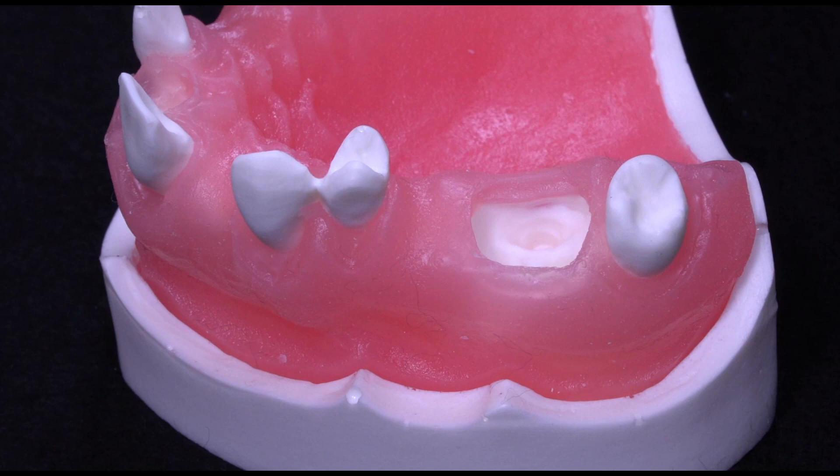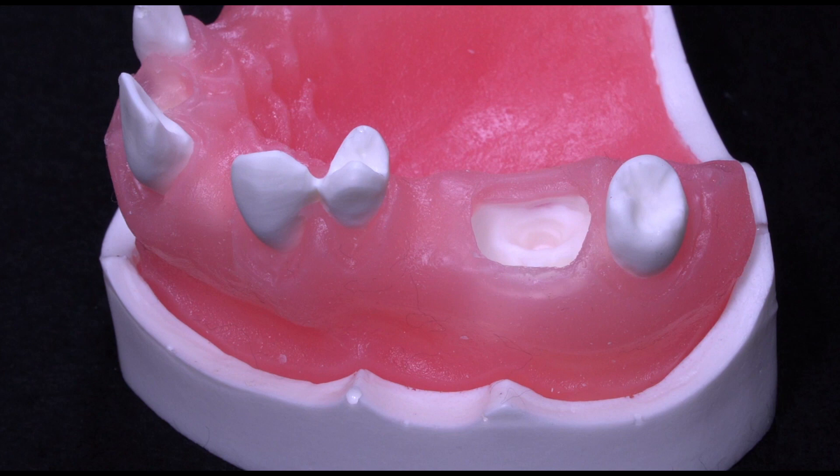Following tooth extraction, ridge preservation is indicated to maintain bone volume prior to dental implant placement.